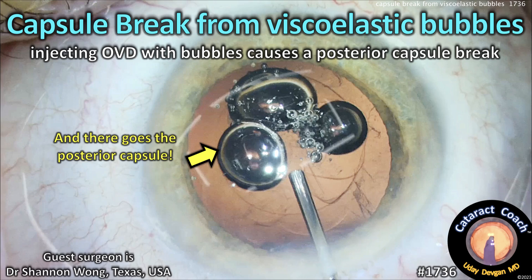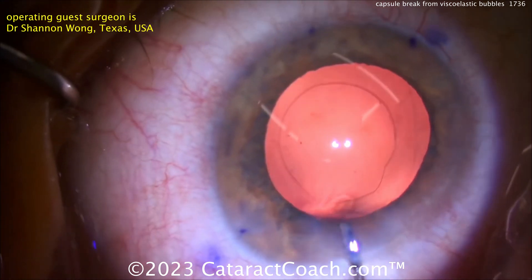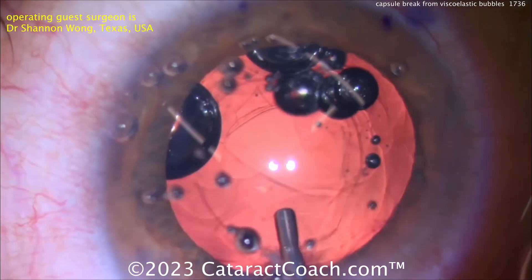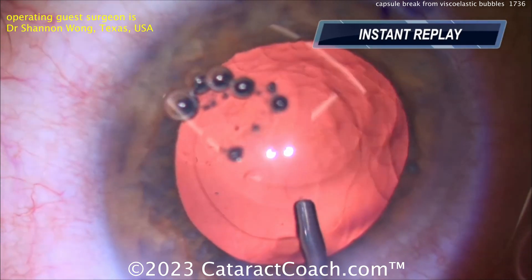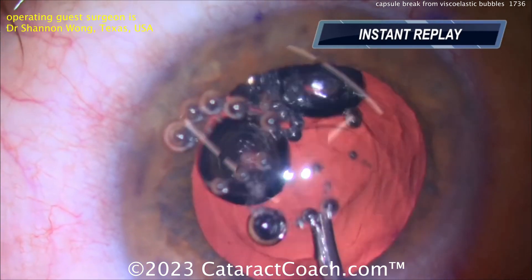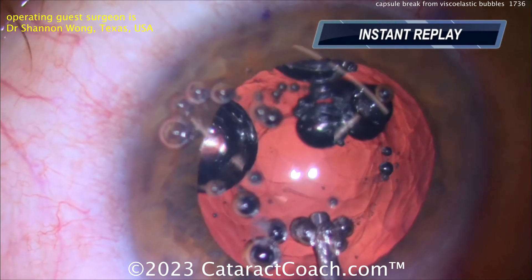CataractCoach.com: capsule break from viscoelastic bubbles — a complication I've never seen before. Watching a video by Dr. Shannon Wong, you can see an empty capsular bag, then viscoelastic is injected and just like that — the capsule is open. That big bubble under pressure ripped open the delicate four-micron-thin posterior capsule.